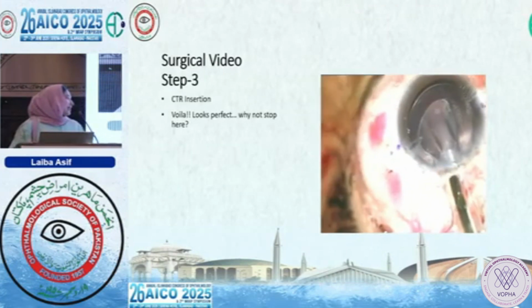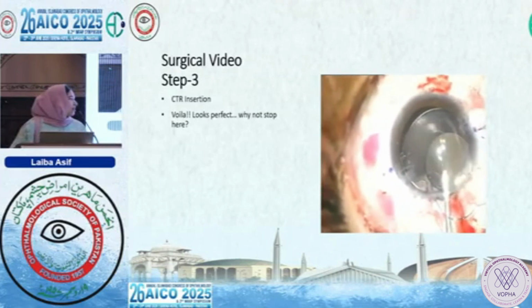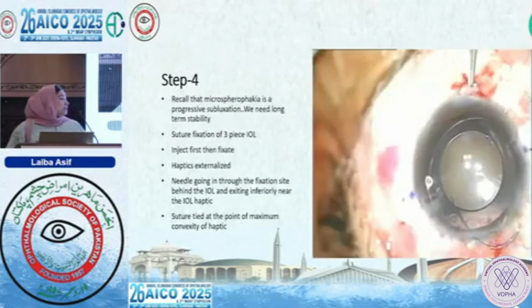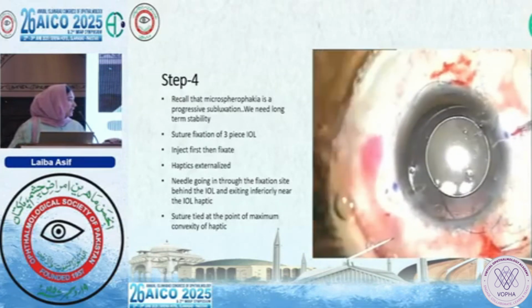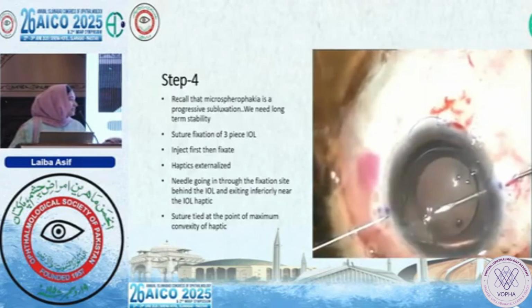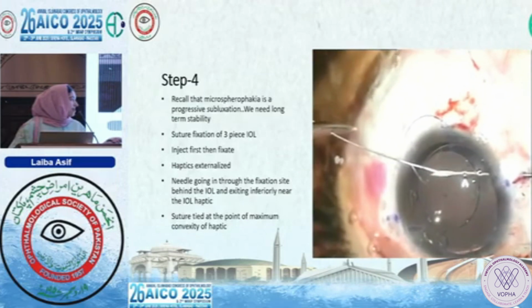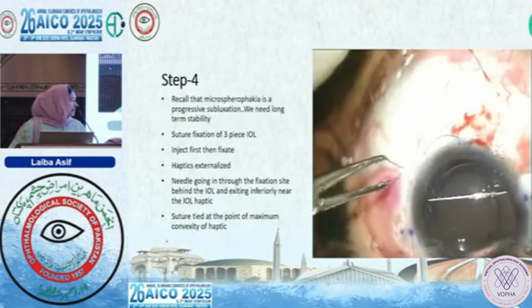Our professor decided to move on with the fixation of this IOL. This IOL was fixated with the help of sutures, as we can see here. The haptics were externalized first, then the suture was entered from the fixation site here. Here you can see the needle entering the fixation site. This needle will be retrieved here, at this site, where the haptic is already lying outside. You can see here.